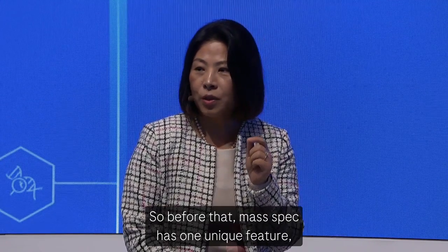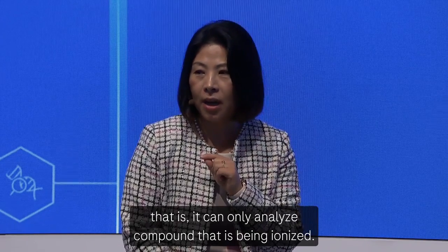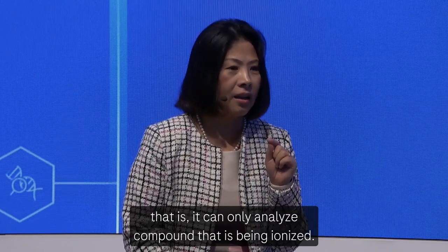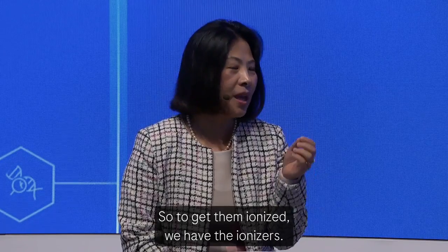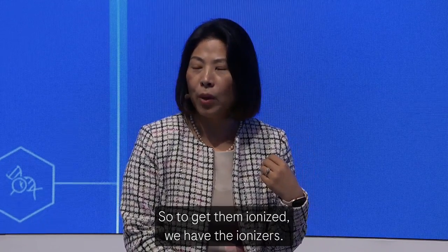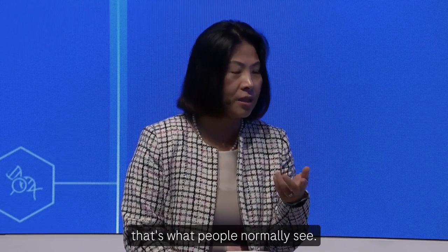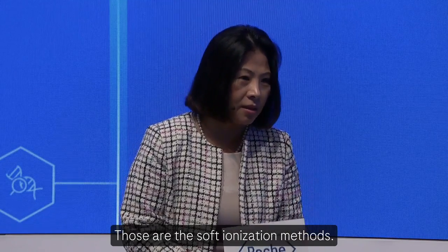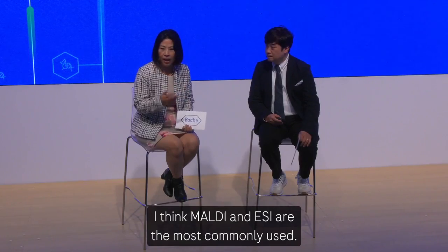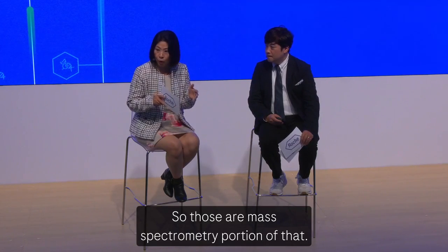Mass spec has one unique feature: it can only analyze compounds that are ionized. That's why the title also mentions ions. To get them ionized, we have the ionizers. Electrospray ionization is what people normally see, and MALDI is another one. Those are soft ionization methods. There are several others, but I think MALDI and ESI are the most commonly used. So that is the mass spectrometry portion.